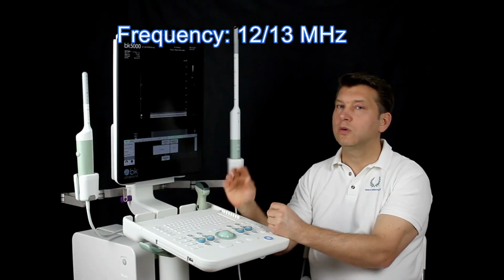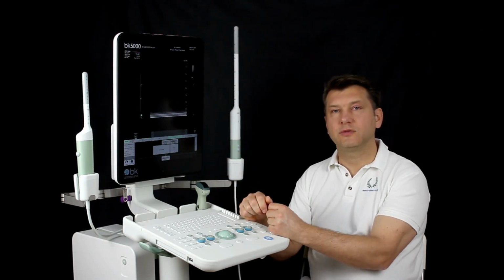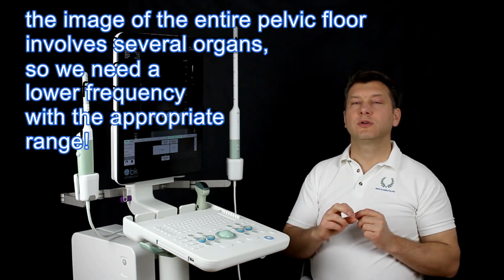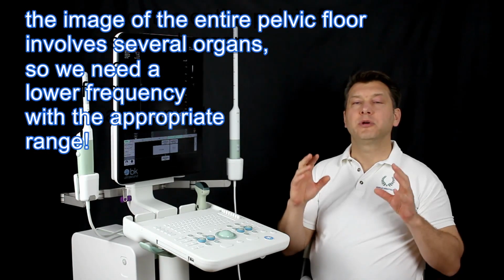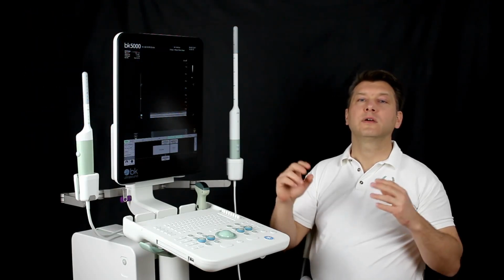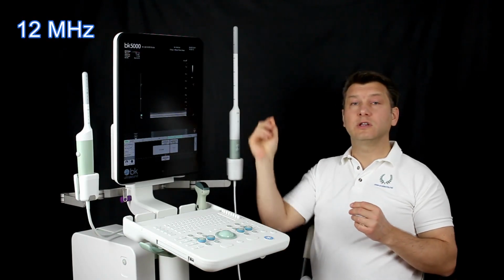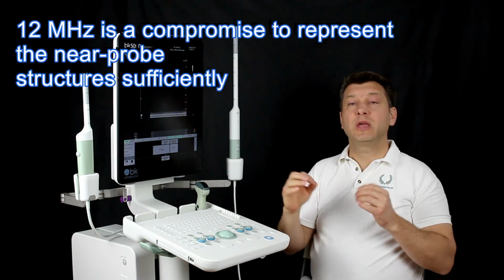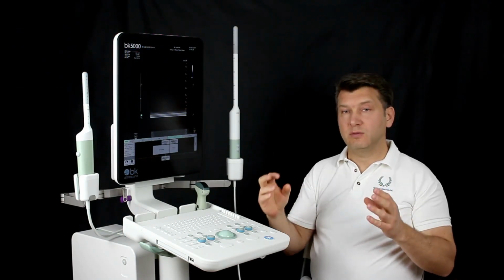Frequency 12 or 13 MHz. Because the representation of the entire pelvic floor involves several organs, we need a lower frequency with the appropriate range. 12 MHz is a compromise to represent the near-probe structures sufficiently. Structures far away from the transducer would be represented as well.